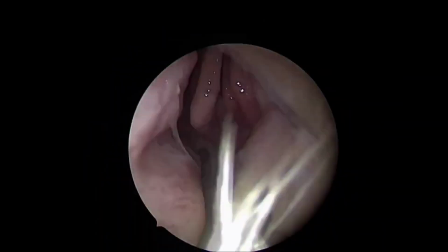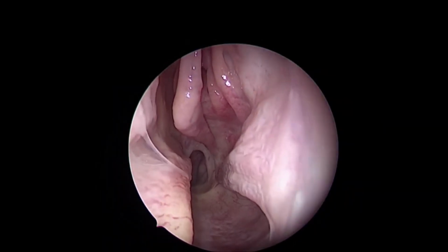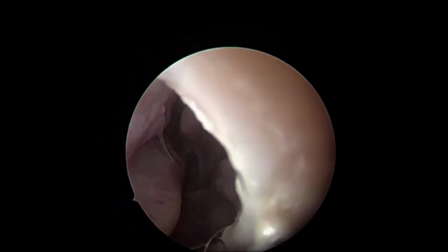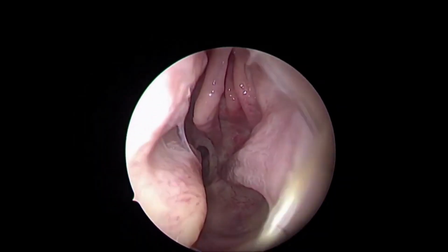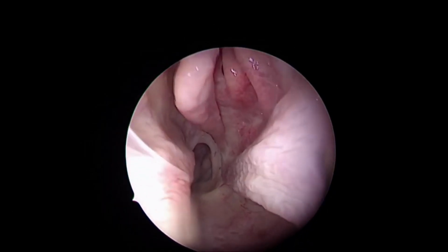And after that, we'll go to the surrounding areas. We'll discuss something about the nasolacrimal system, the Denker's approach, then the pterygopalatine fossa, infratemporal fossa, sphenoid, skull base, cavernous sinus, orbital apex, and then move on further to the other advanced skull base approaches. So let's see how much we can do today. Otherwise, we'll carry on further.